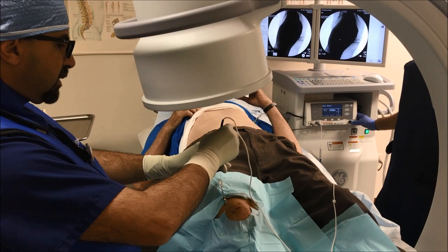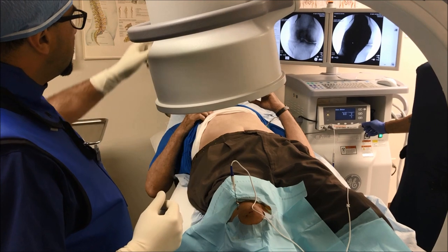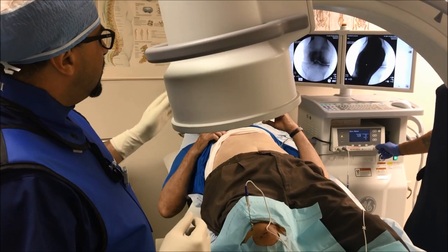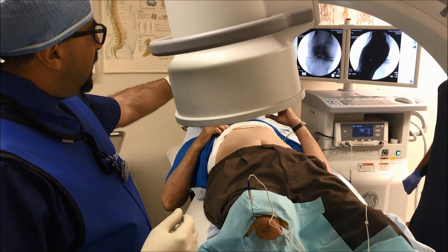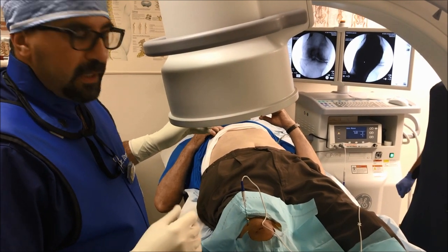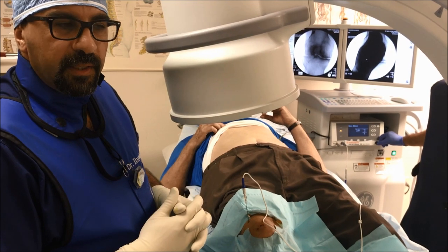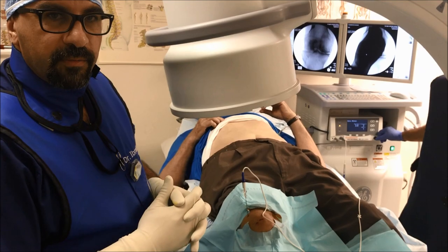We will do the testing and start utilizing the probe — this is how the probe looks. This location is between the shaft of the femur and the femoral condyle. We apply the same on the medial side, and again on the medial side of the tibia where the shaft meets the tibial plateau. By doing that, we cauterize the three major genicular nerves: the superior medial, superior lateral, and inferior medial genicular nerves.